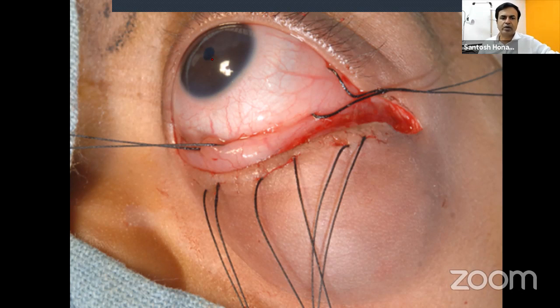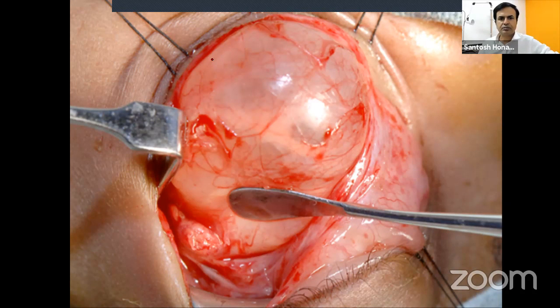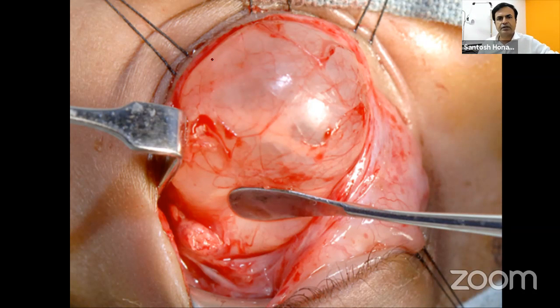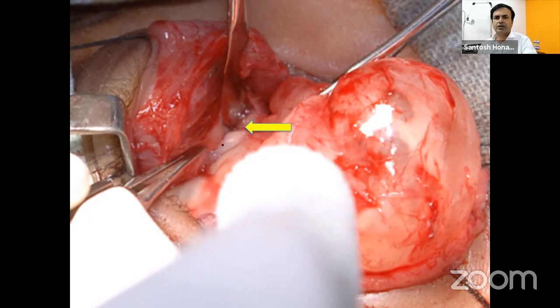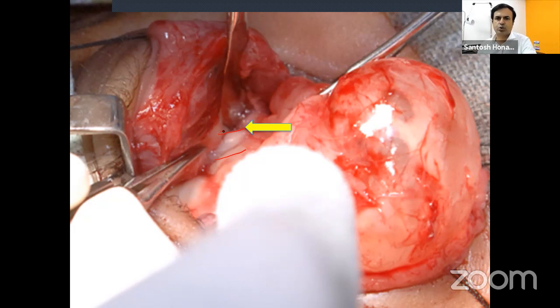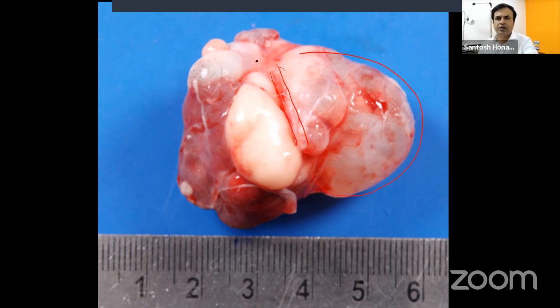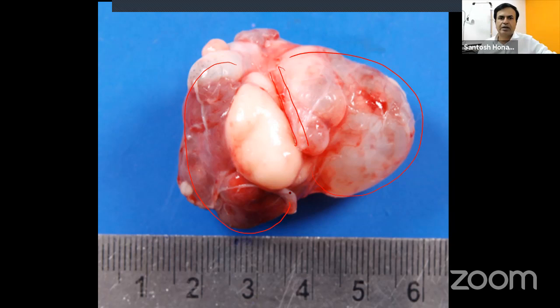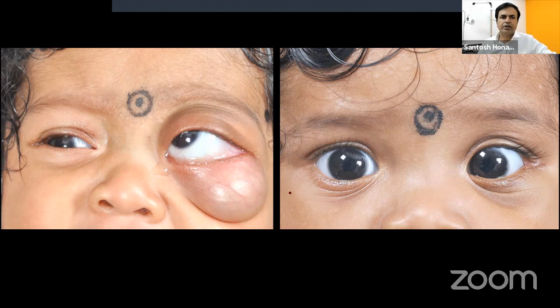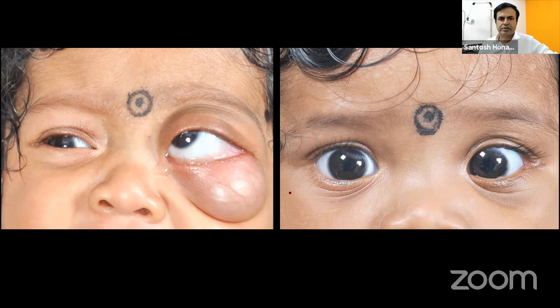Using a swinging eyelid incision with medial extension, the lateral cystic component was dissected and the optic nerve was never touched — it appears as a pearly white structure under the microscope, with the solid lesion medial to it. The entire lesion including the lateral cystic and medial solid components was removed through this one incision. The child did well, disc appearance returned to normal, though strabismus correction was still needed.